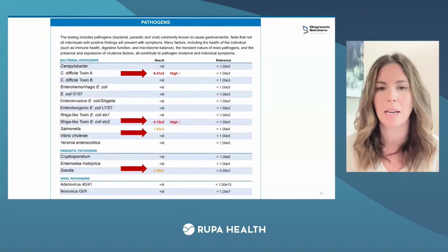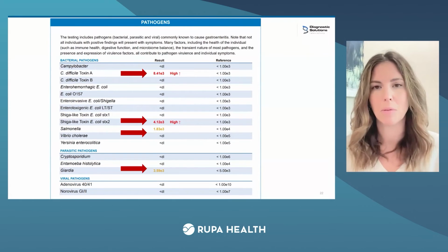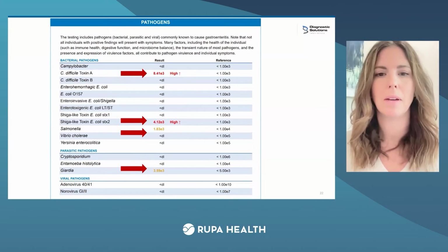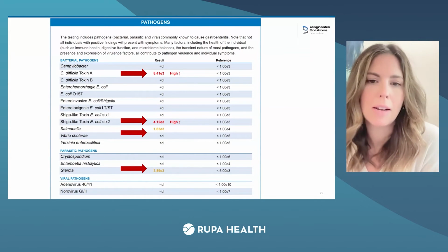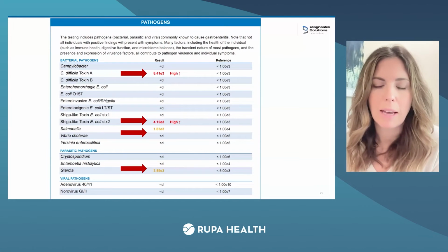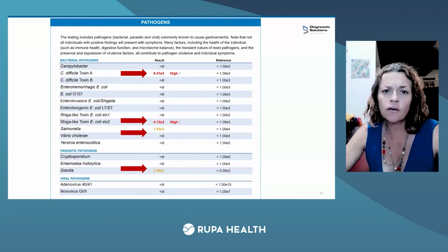Because salmonella is really uncommon to find chronically. We see it sometimes rolling through and then it's dealt with. Now at the E3 level, this is more than just an incidental exposure. This has to at least somewhat increase in volume or population to show up at this level. So it's a decent amount, but not a severe infection amount. So how did this person feel within the couple weeks before or a couple weeks after this test, or even days?